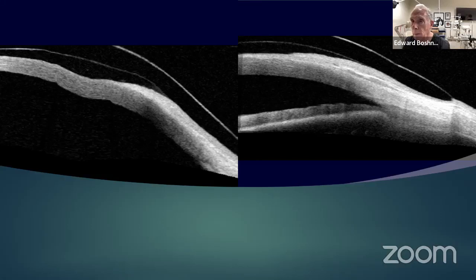There's a German company called Heidelberg that has come out with a new anterior seg OCT called the Anterion, which they haven't really marketed, but that's available maybe in Europe by Heidelberg. And I'm sure Zeiss and other companies are going to be coming out with anterior seg OCT. Yes, for the OCT AS, most of the companies now are offering this possibility in their OCT. It has become something very natural.